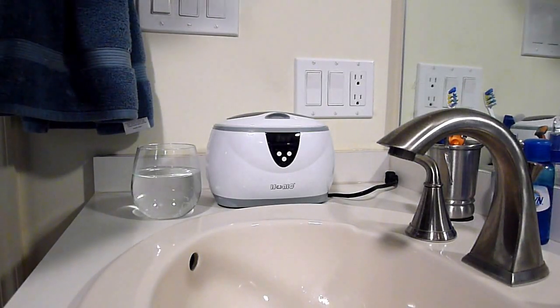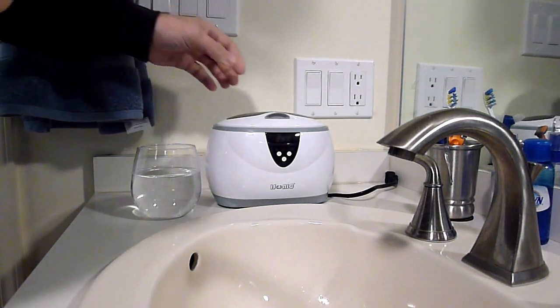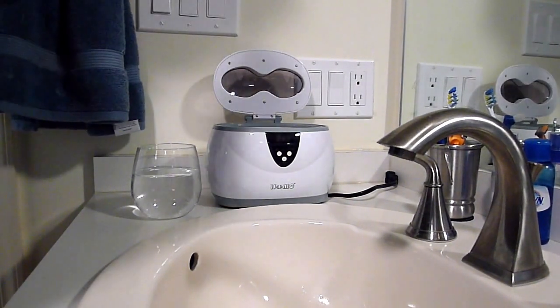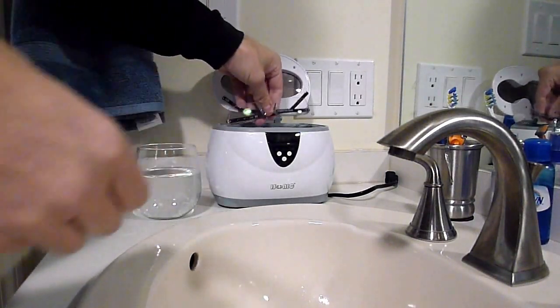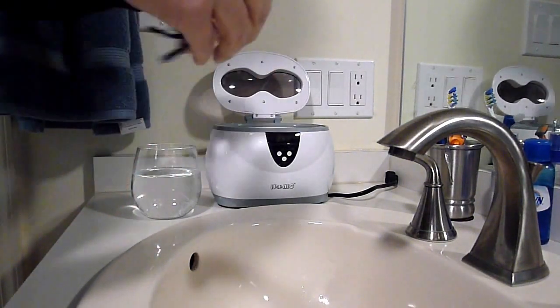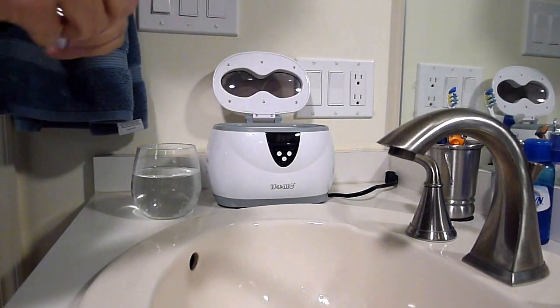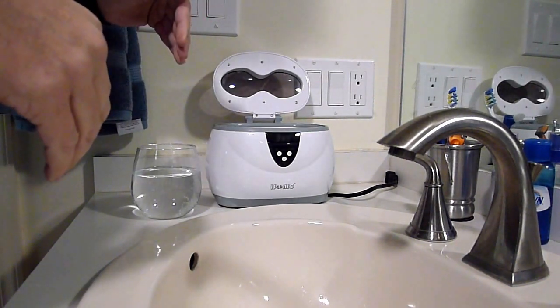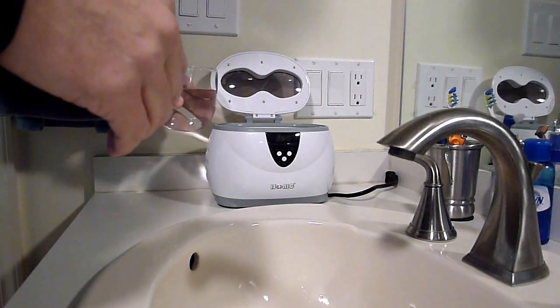I'm going to give you my instructional slash review of the iSonic i3800A ultrasonic cleaner, which can be used for dentures. You can also put glasses in here very easily — there is a little basket included. The directions recommend that you use simply warm water in here.